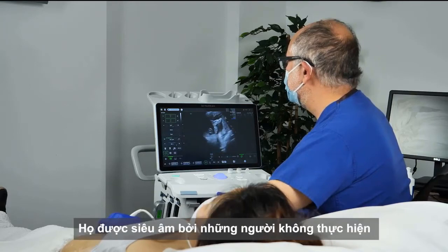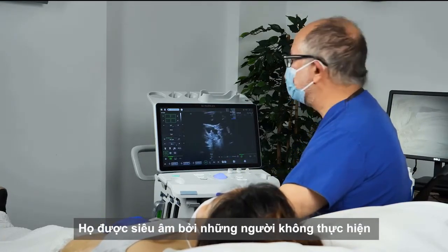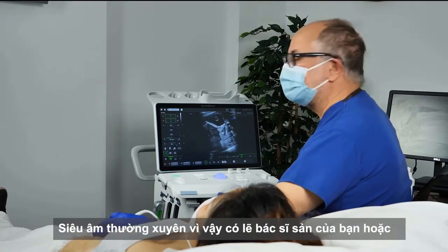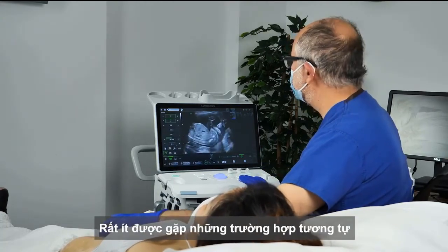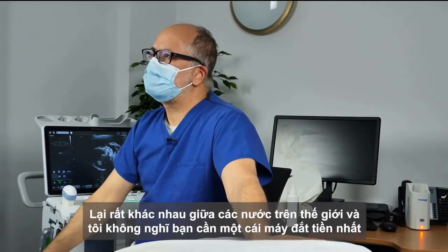In some countries, they have ultrasound in the hands of people who don't regularly do ultrasound. So maybe your general obstetrician or your general gynecologist who does very few cases, may find something like this really, really helpful. So the standard of care is very variable around the world.